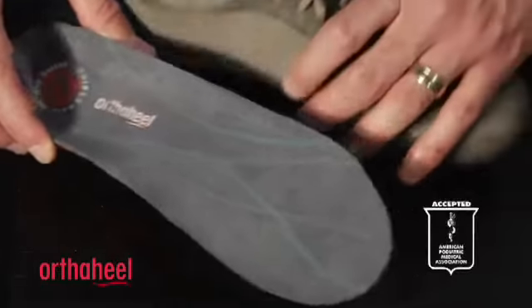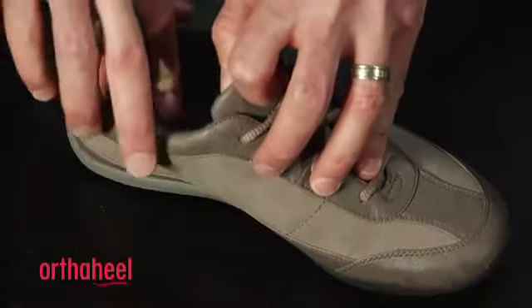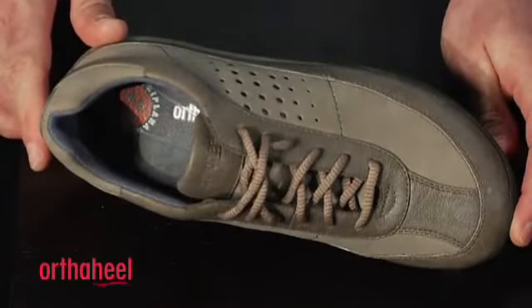This is the ideal style to fit into really any kind of shoe where the insole can be removed, like a lace-up, a casual shoe, a loafer. As you can see, when the insole comes out, that's the one to put in. The Relief Full Length Orthotic — a great option for shoes with removable insoles. Give them a try.